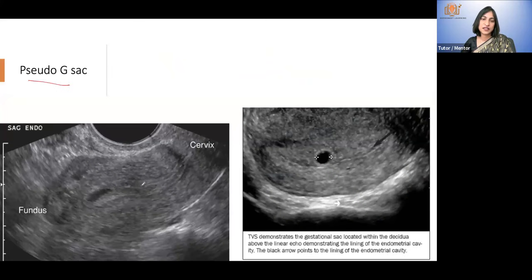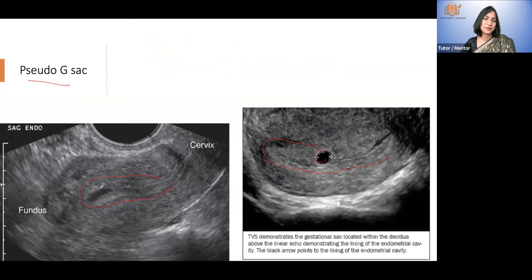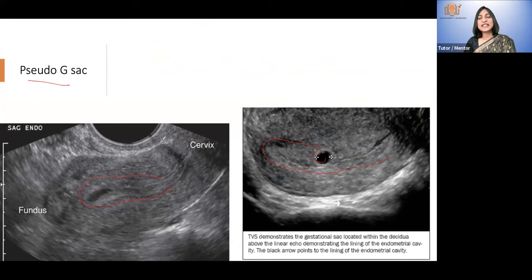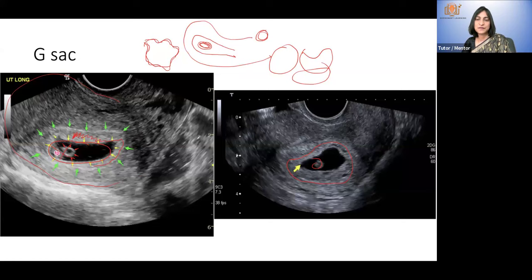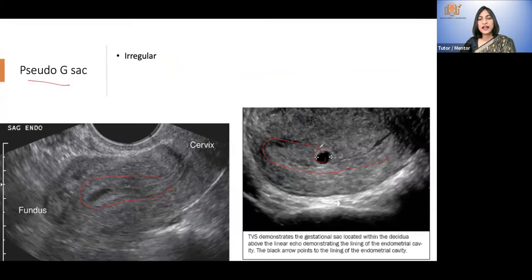Here you see the endometrium is nicely decidualized — a thick endometrium — but just a simple fluid-filled space, which is the pseudo-gestational sac. It does not have the intense choriodecidual reaction seen in a true gestational sac. The white reaction in a true gestational sac is localized around the sac, not throughout the cavity. The key distinguishing feature is that a pseudo-gestational sac does not have the double decidual ring sign, and it can be irregular.